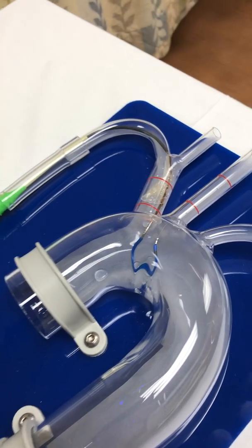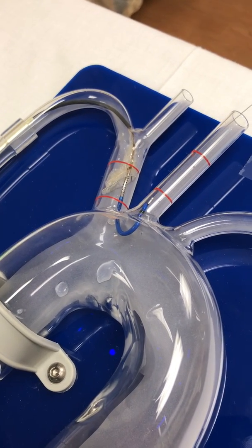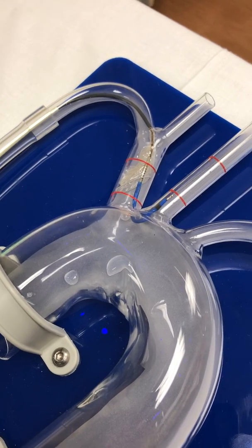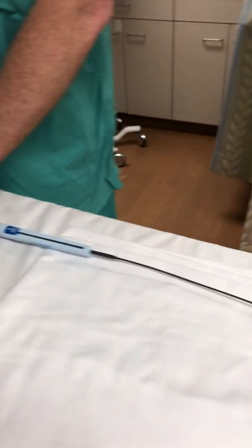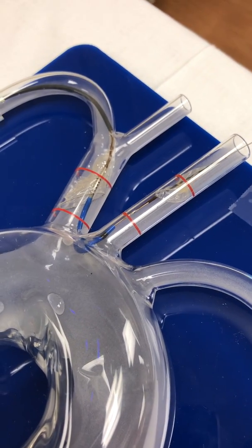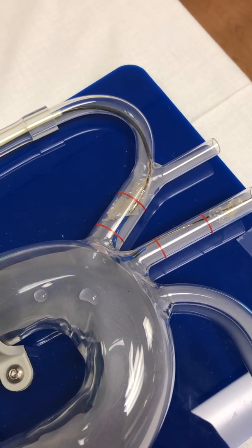Now he's going to advance the wire up into that left common. Once it's in there, we're going to spread the handle back and snug it right up to the carina so it's out of the way for the TAVR equipment. Once he feels pressure and can't advance any further, we're going to deploy the distal filter, which is number three — carefully deploying it into the left common. If you meet resistance, you can lightly touch number two to adjust the angle of deployment. That's how it's going to stay during the TAVR procedure, again with an ACT of 250.